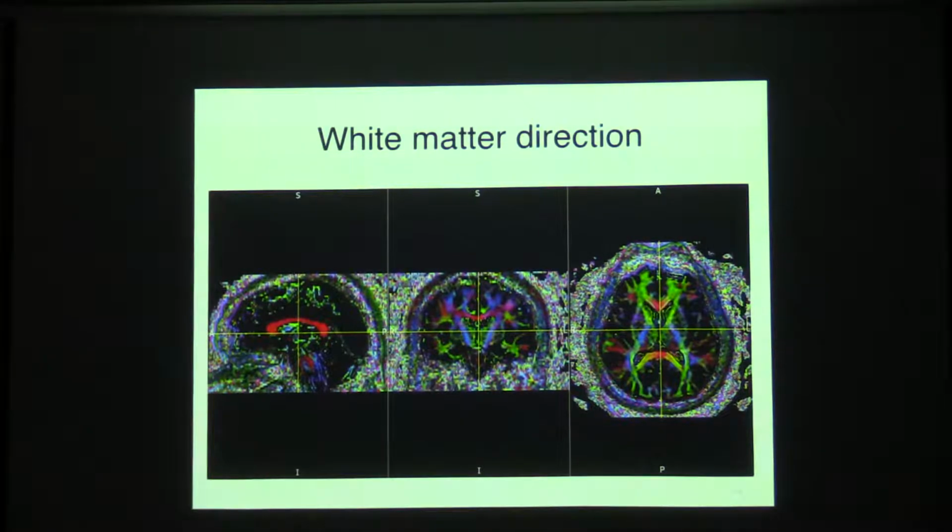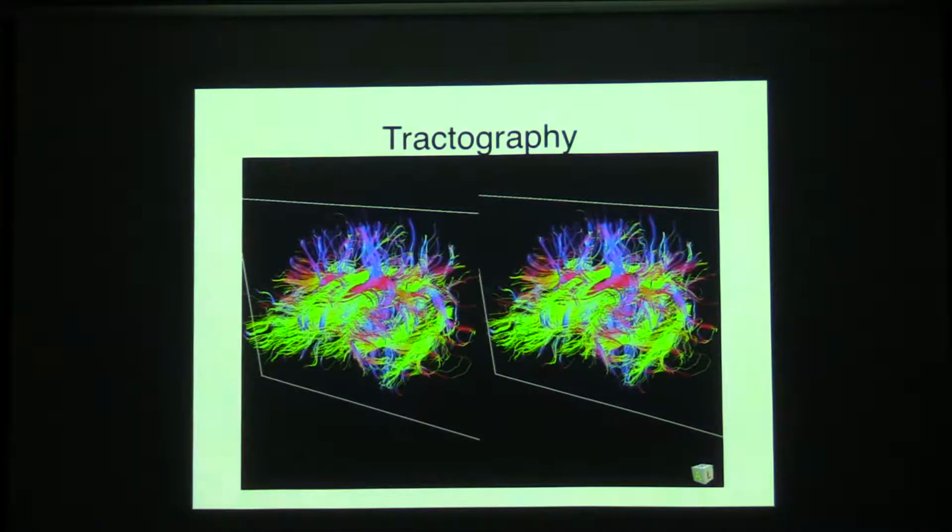So one of my fellows actually had a really good way of trying to remember this: sideways is stop, so that's red, okay? Anterior to posterior is go, so it's green. And then superior to inferior, cranial to caudal, is blue like a waterfall. So, a beautiful way of trying to describe that.